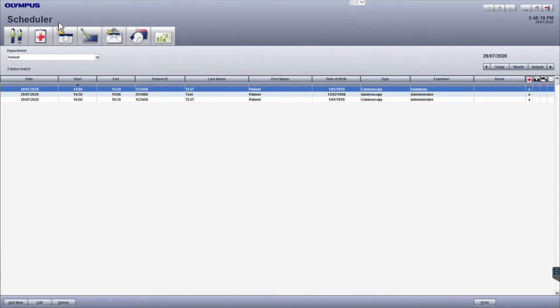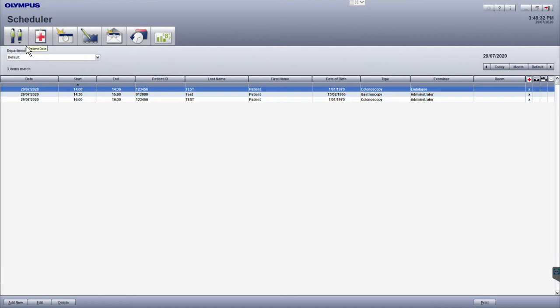When Endobase opens, you will see the scheduler, which is the home screen of Endobase. At the top of the screen, you will see different module icons to perform the different functions within the software. To navigate through Endobase, we progress through these different modules from left to right to complete the full documentation workflow.